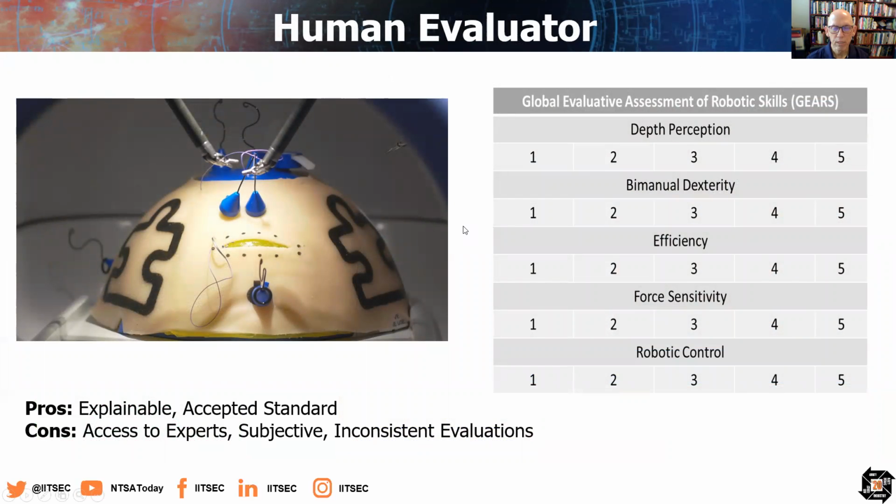So we present these videos to humans to evaluate, and typically we present them with the dry lab and the wet lab exercises, but not with the simulator exercises, which I'll explain on the next slide. When a human has to assess those dry lab exercises, they use a tool called the Global Evaluative Assessment of Robotic Skills, which has been validated by the community and is widely used for assessing robotic surgeons.